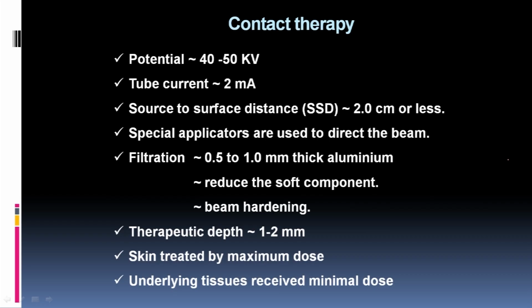Now contact therapy. This is a very useful therapeutic kilovoltage unit which is used for various skin tumors and other superficial tumors which have 1 to 2 millimeter of depth, and contact therapy is still used in certain clinics.